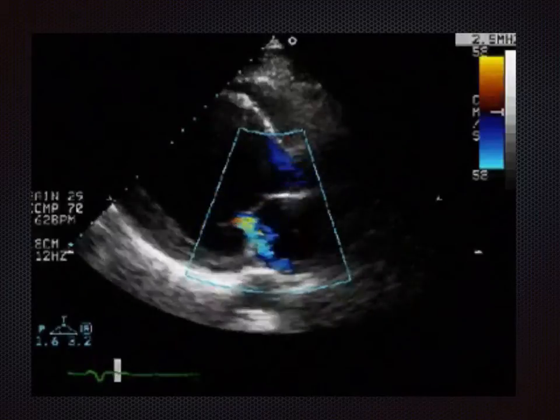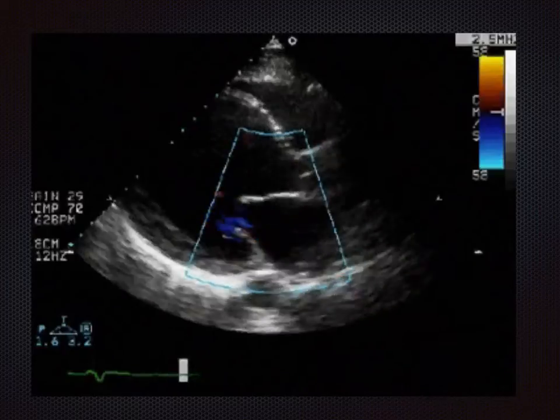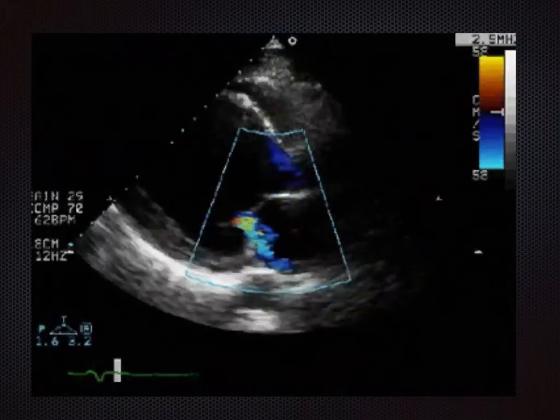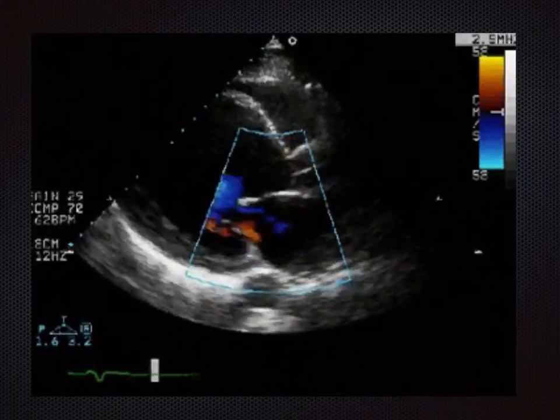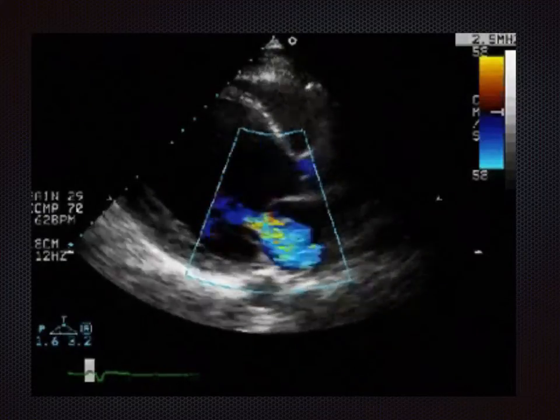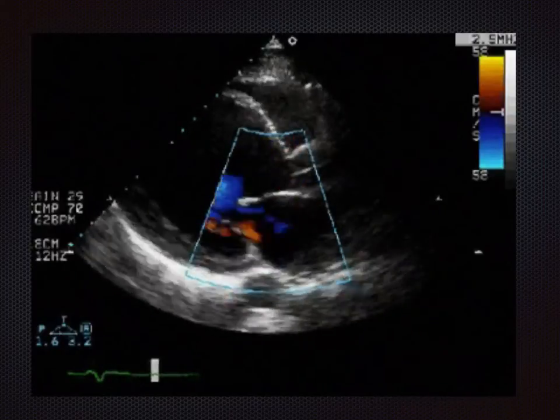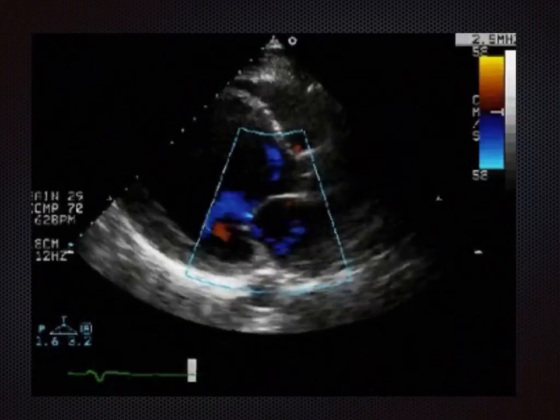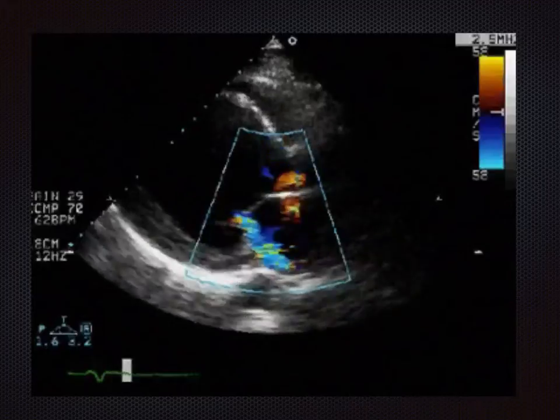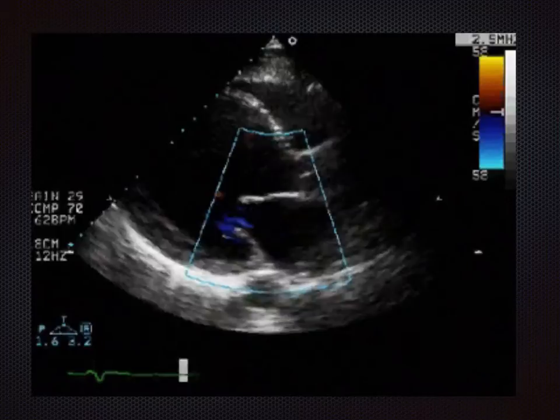So when we look at something like this, you see with the mitral valve, the blood is coming back during systole, and the regurgitant jet must be quite narrow, so it's showing up as mixed colours with a little bit of greening, which would indicate that this is quite turbulent flow. So when it's not turbulent flow and not at grossly high velocities, you would expect it to be more a typical blue or red. So we need to just understand a little bit more about valves.